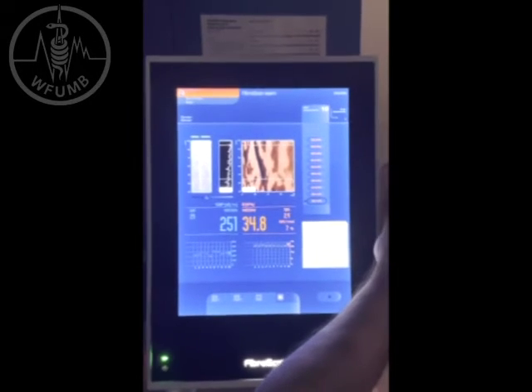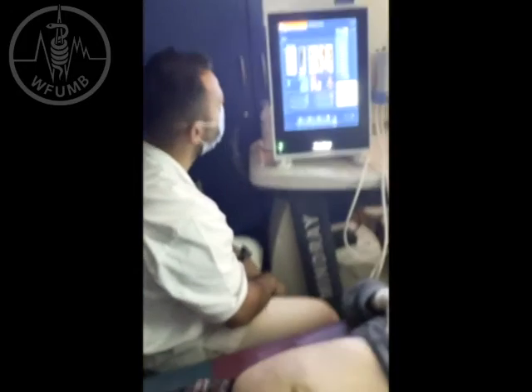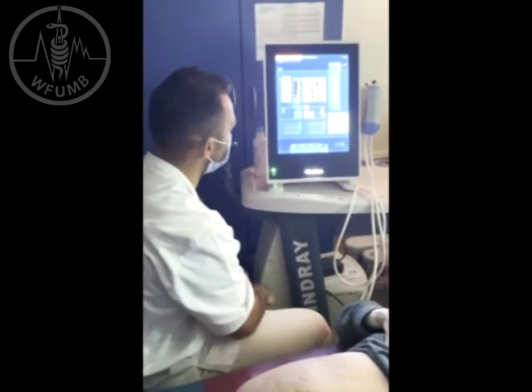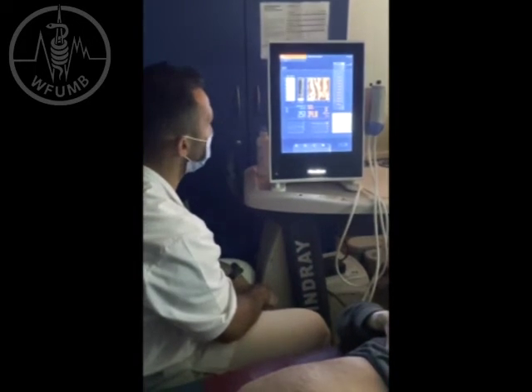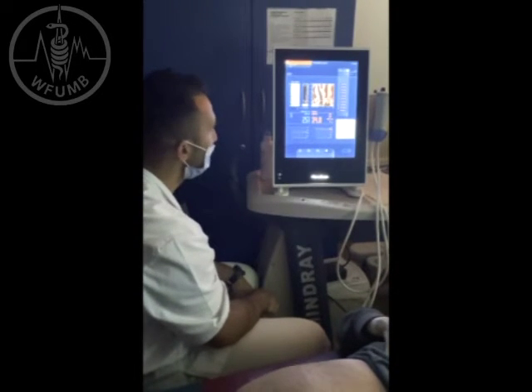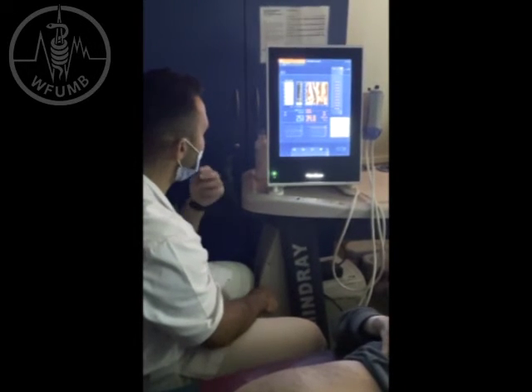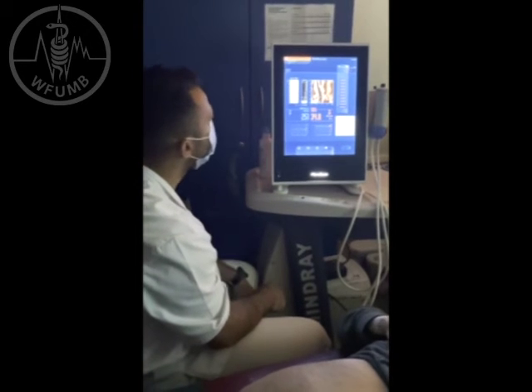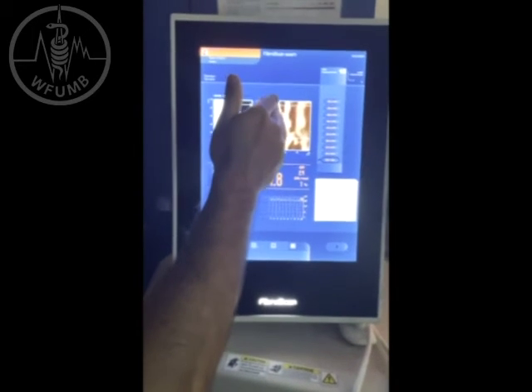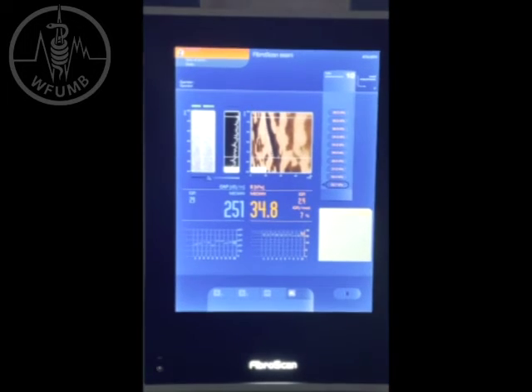This value corresponds to liver cirrhosis. There are many meta-analyses which have appeared, and a value of above 12 kilopascals indicates a high probability that the patient has liver cirrhosis. Also, you can see this is another guiding system for performing FibroScan.